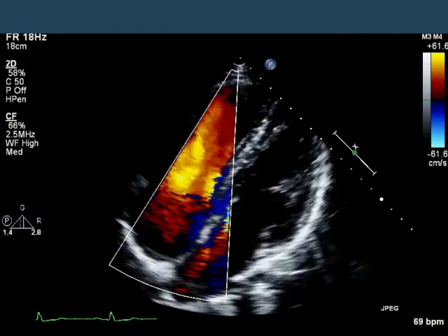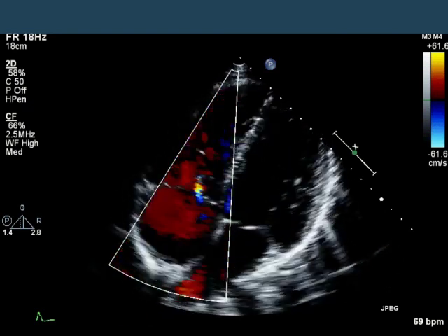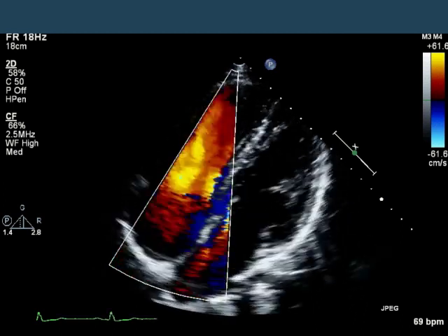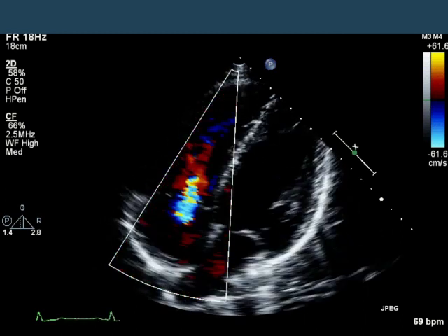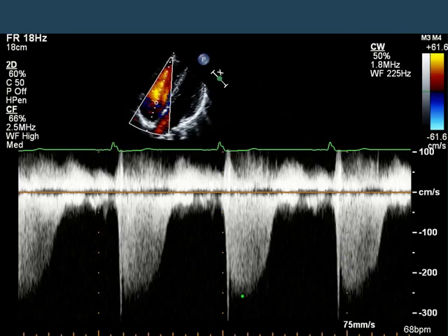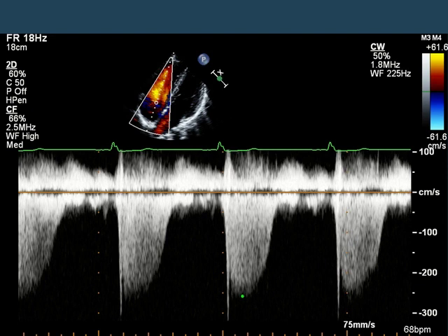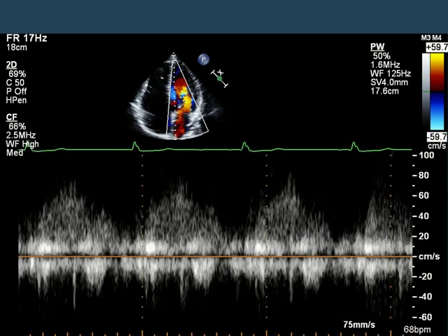In the next slide we have a color view of the tricuspid regurgitation. The TR I would characterize as no more than mild. In the next slide, you can see a continuous wave Doppler through the tricuspid valve. The peak velocity here is about 2.6 meters per second, which argues against any significant elevation in PA pressure. PA pressure here is probably in the vicinity of about 31 or 32 millimeters of mercury. We also see a pulsed wave Doppler through the right superior pulmonary vein, with an S wave and a D wave that are very well demarcated — not unusual in any way.